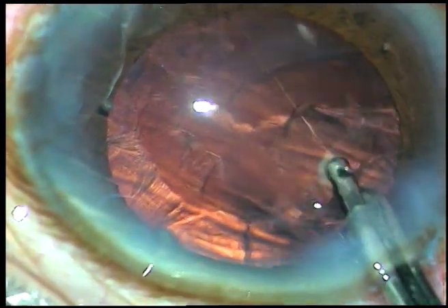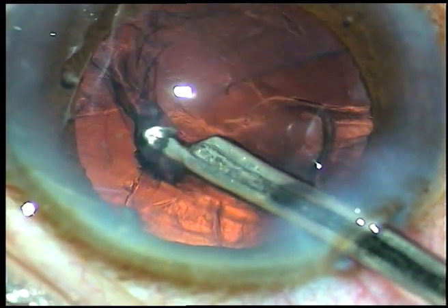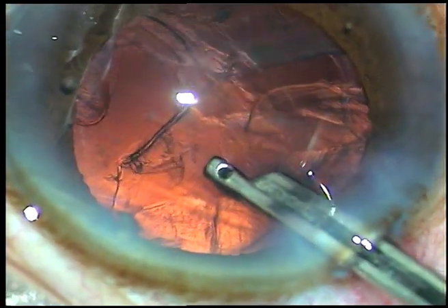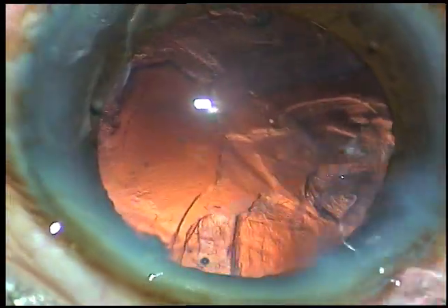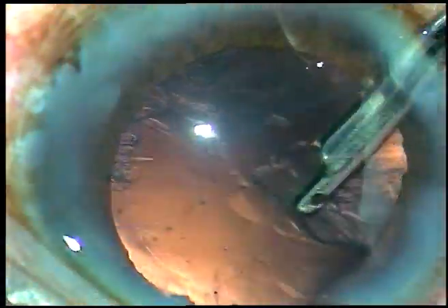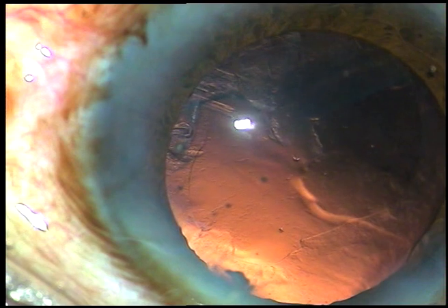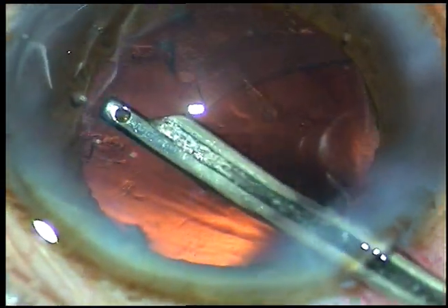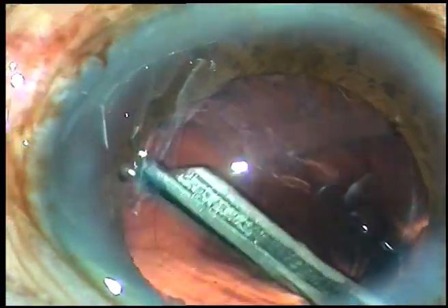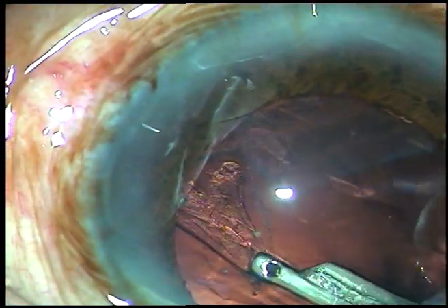Since there is a CTR, we have to be patient. It takes longer time than usual when there is a CTR, and we have to hold the cortex very nicely and then pull it. Since the CTR is supporting the bag, there is no fear of zonular dialysis at this moment. Now I am removing the cortex from 3 o'clock and 4 o'clock.